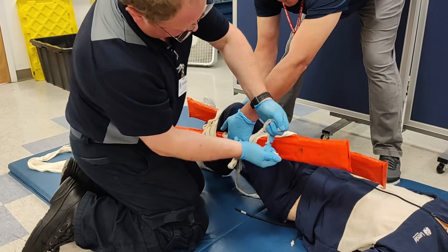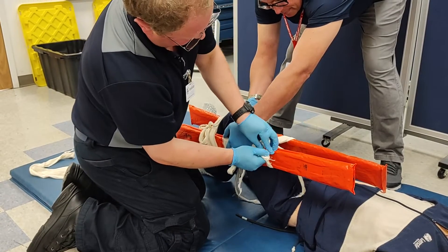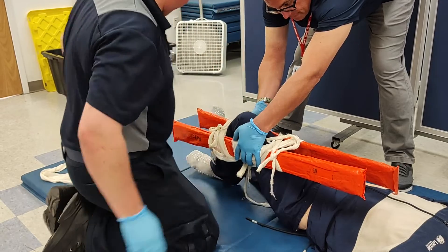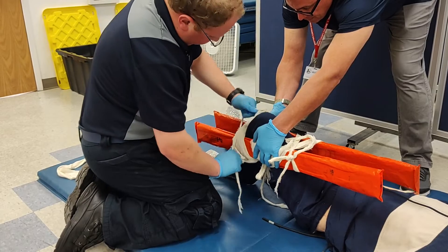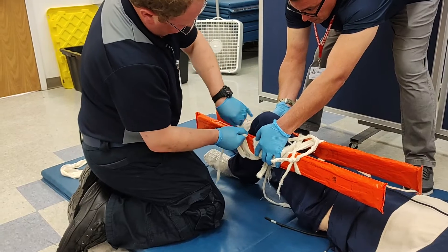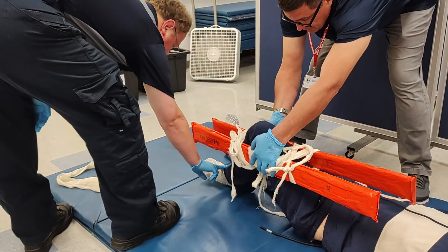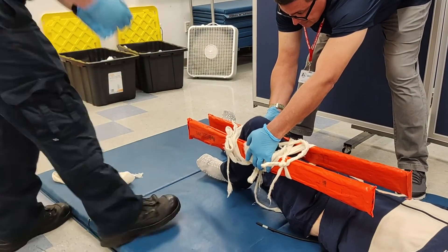Lastly, the end cravat is tightened to ensure stability during transport. Once tightened, distal PMS is assessed to ensure the splint is not overly tight. This patient is now ready for transport.